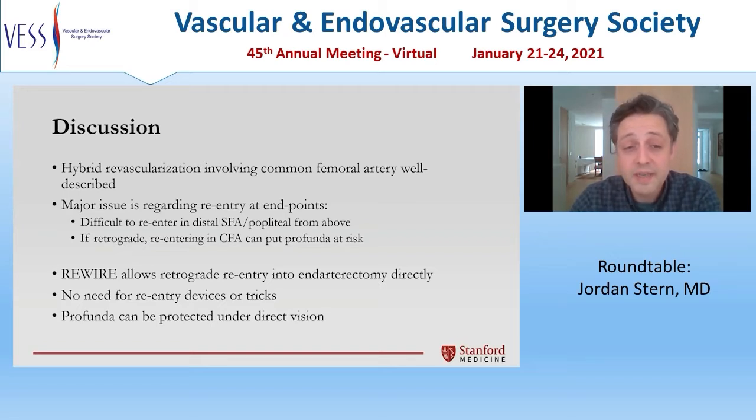This REWIRE technique allows retrograde reentry into the endarterectomized segment of the common femoral artery, which mitigates the risk of propagating more proximally. There's no need for a reentry device or any other tricks that the endovascular operator may generally use for reentry when it becomes difficult. Finally, the profunda femoris can be protected under direct vision without any risk of compromise of flow.